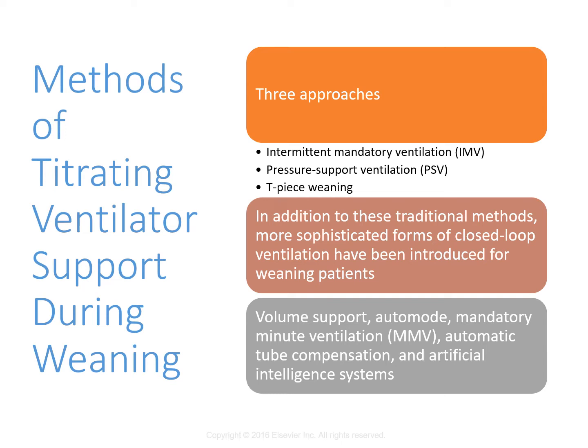So these methods have also been compared with forms of closed loop ventilation, which include volume targeted pressure support ventilation, so volume support ventilation, if you will.